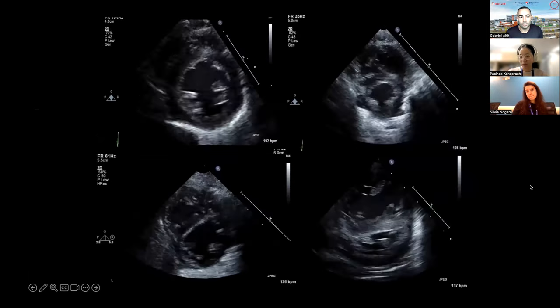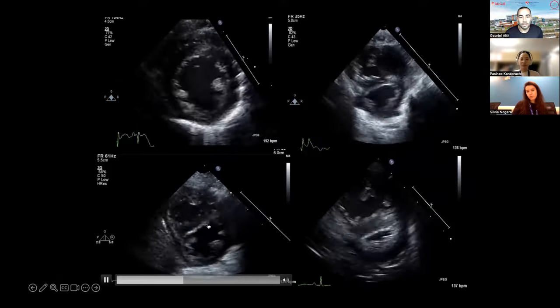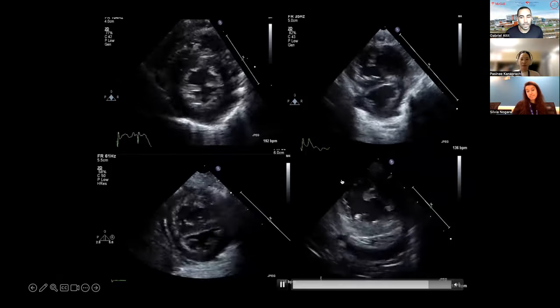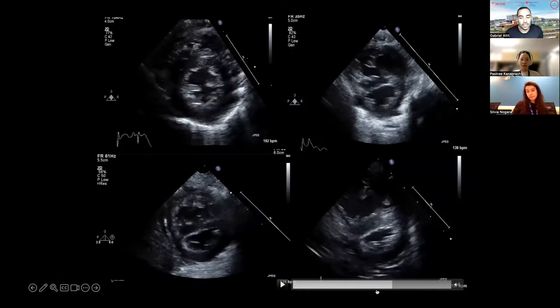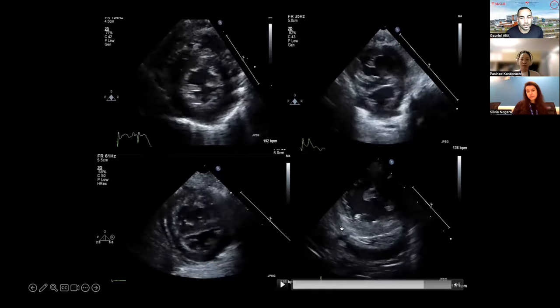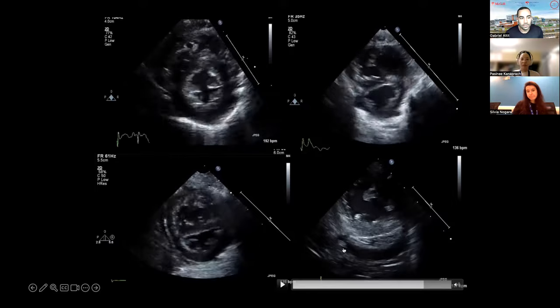These are different examples of septal flattening. This one is terrible. You can see that this RV is extremely hypertrophied. There's septal hypertrophy, and the LV is actually pancake. Look in systole, the cavity is almost obliterated. Right? You see that? Yes?